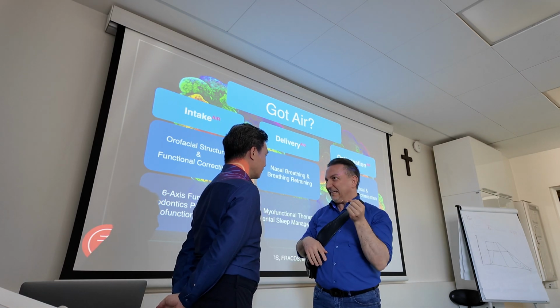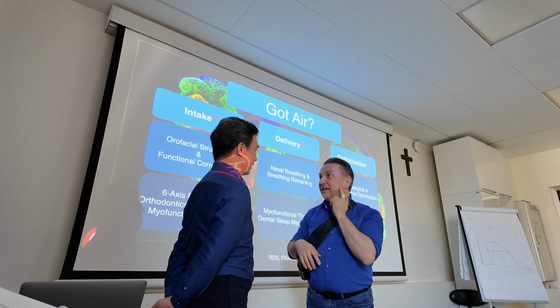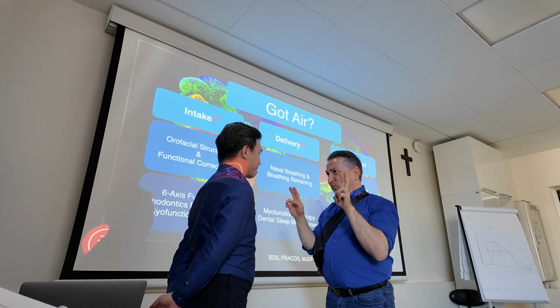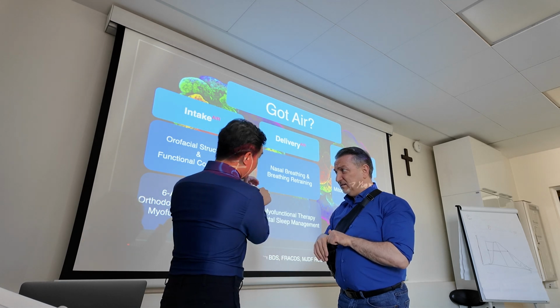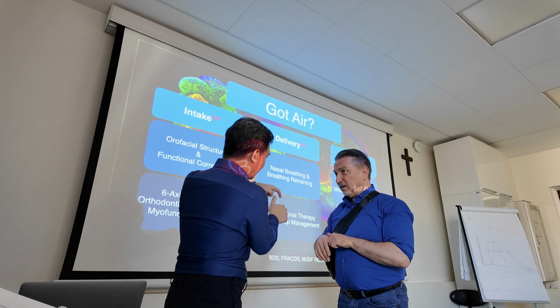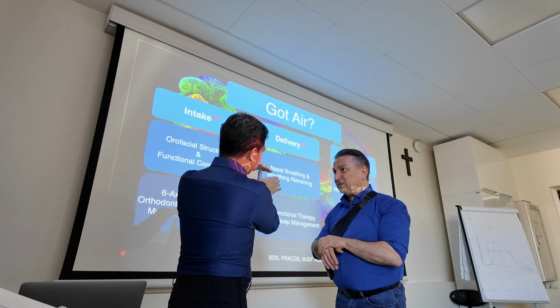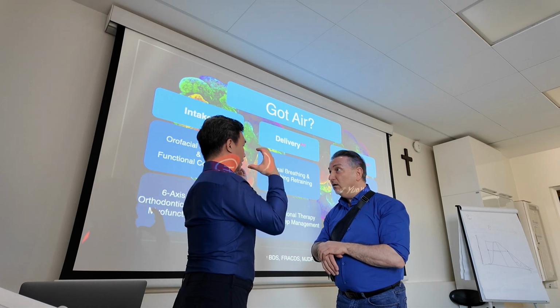Yeah. We call it clicking in Germany. Oh, clicking? Yeah. Is there a reason for that? Yeah, because the space is smaller, and the oscillation is moving out and then clicking in. And how can we solve this? You can make more space, you can actually increase the volume.